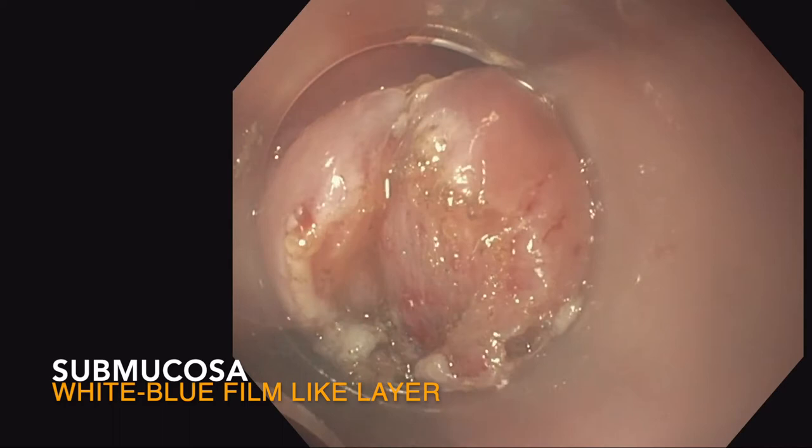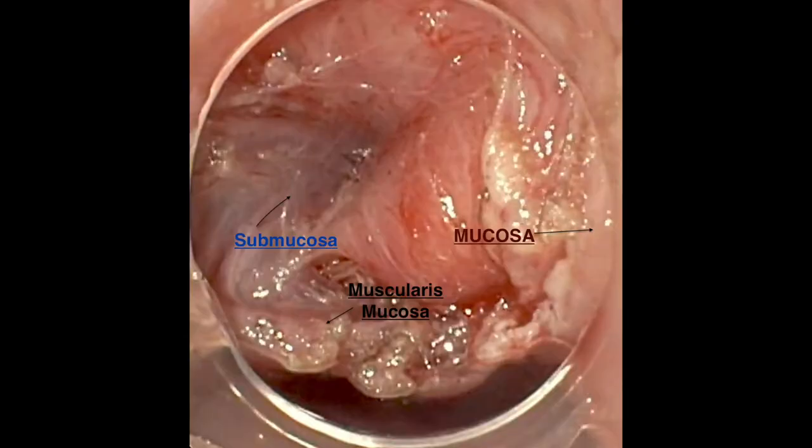That white film-like blue layer is important to note, because once you get beyond this layer through the submucosa, you'll see exposure of that cricopharyngeal muscle, which you can see just a little bit in this picture. It's important to understand the layers so that you perform a complete dissection, reducing the risk of recurrence.